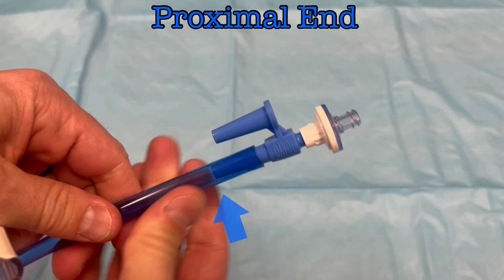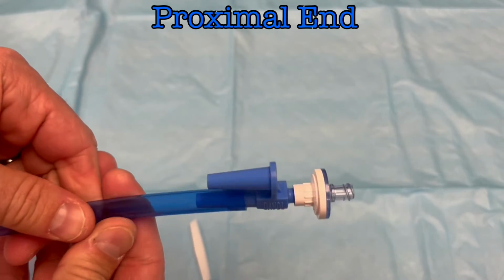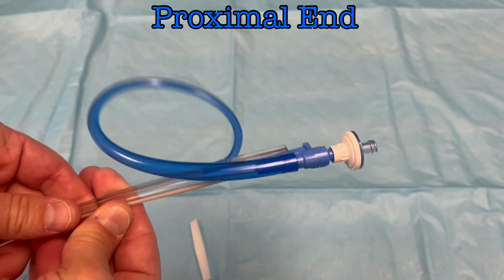The other opening is a small blue pigtail with a filter inserted into the end. This tube allows environmental air to pass freely into the tube and into the stomach to prevent the formation of a vacuum if suction is applied to the NG tube. The filter on the end of the pigtail is an anti-reflux filter to ensure gastric contents aren't able to exit the NG tube through this opening. Attached to this filter is another small plug. This can be used to plug or cap off the main opening of the NG tube if necessary.